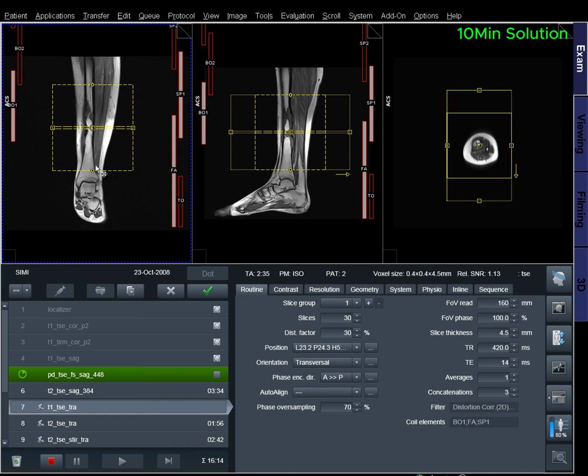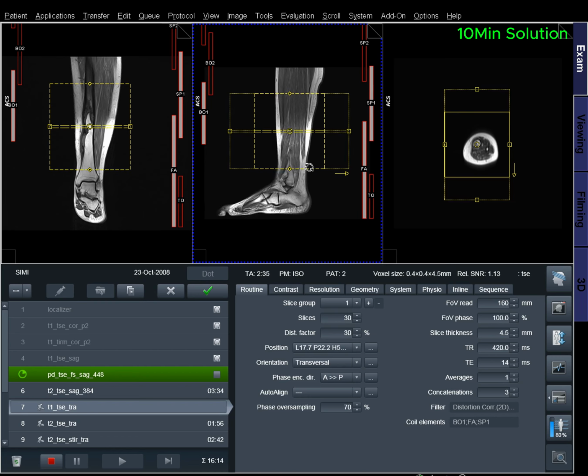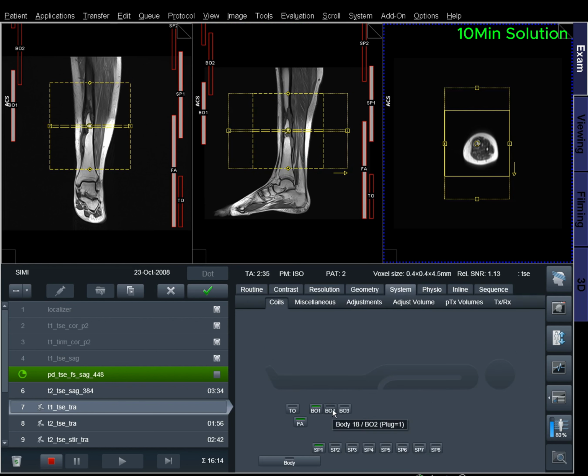An appropriate angle should be applied in the coronal plane, perpendicular to the right and left shaft of the tibia. Ensure that the slices cover the entire lower leg, from the knee joint down to the ankle joint. In case the pathology is localized in one area, perform axial slices only in that specific region.